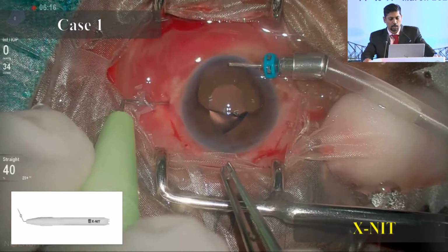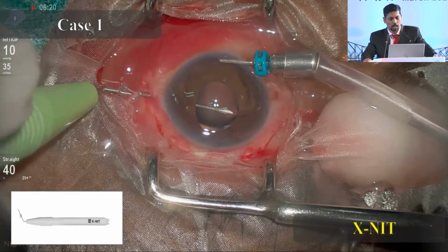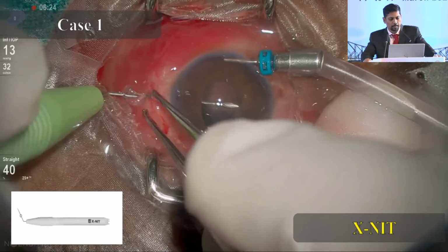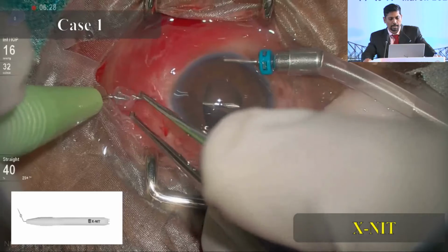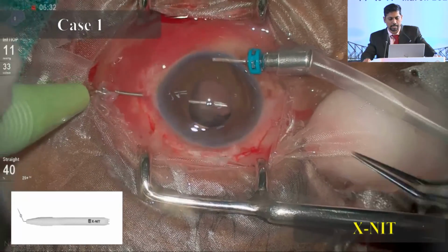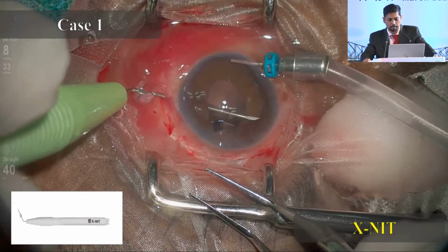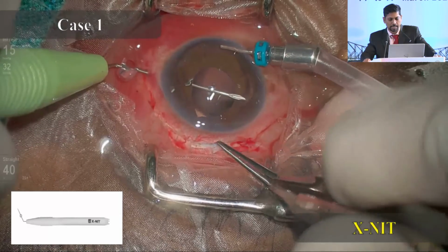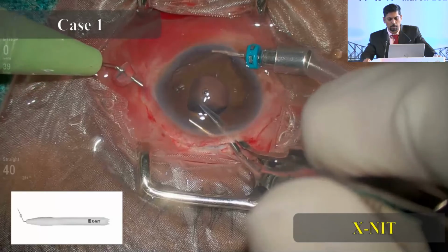Enter, make the sclerotomy, go inside with a long customized 26 gauge needle. Once the needle tip is inside, that is a silicone stopper, a dual protection silicone stopper. It temporarily holds the exteriorized leading haptic, which you will be seeing shortly. Use your McPherson forceps and gently depress the scleral lip, as you can see here, and try to make a sweeping sort of motion.